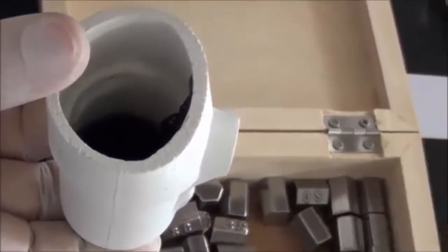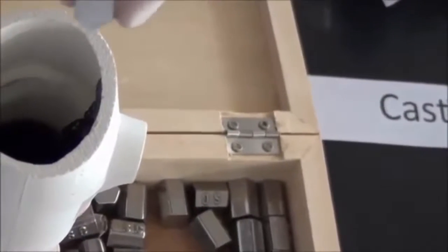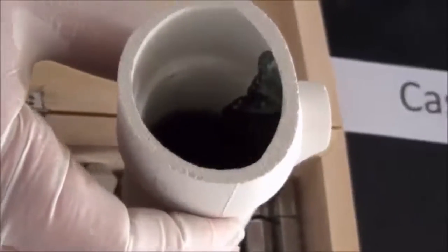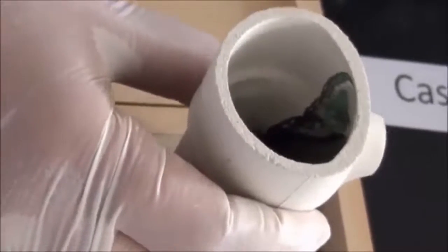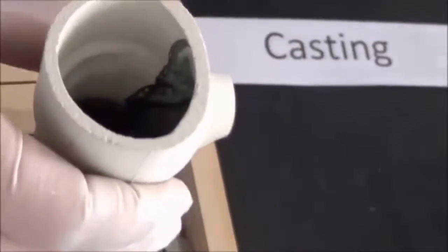These are the ingots of chrome cobalt material. They come in different shapes. This is one of these shapes. It is placed in this crucible and heated until it's molten. If you look inside, as you see, this crucible has the metal still solid. Once heated to the temperature specific for chrome cobalt melting, it becomes liquid, and then a process of centrifugation, fast rotation, will take out this liquid from inside the crucible.